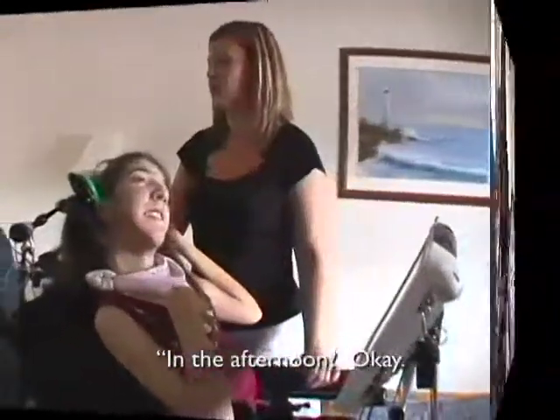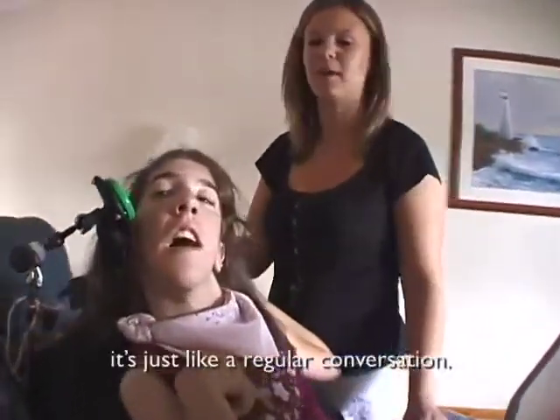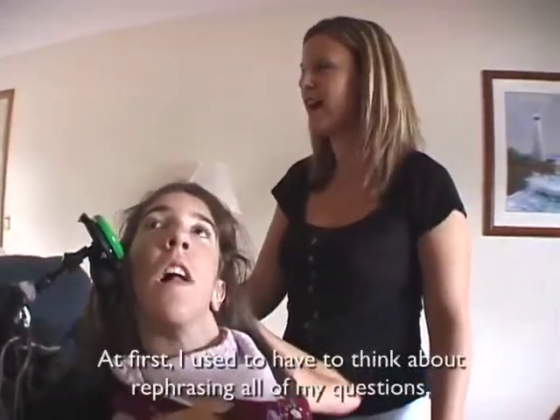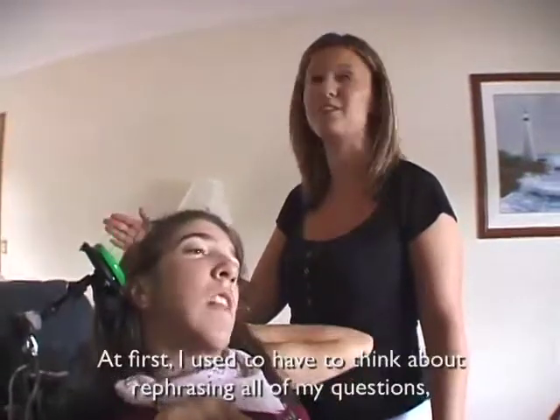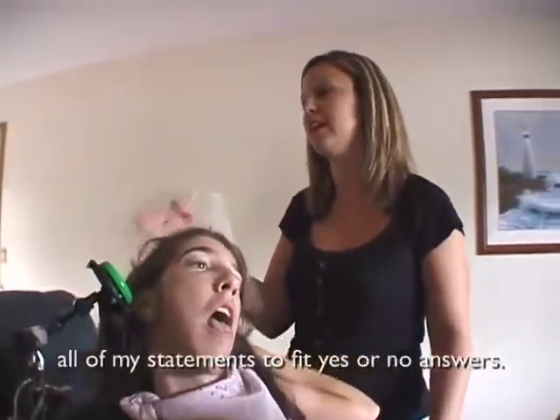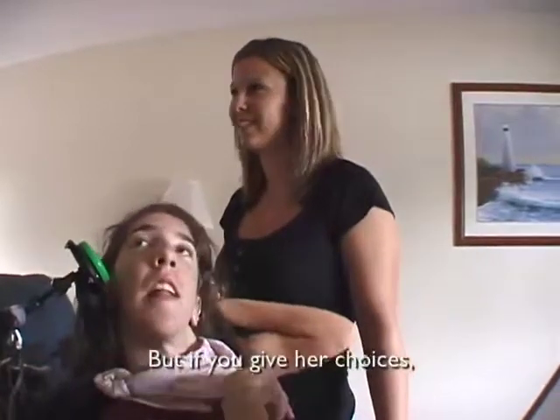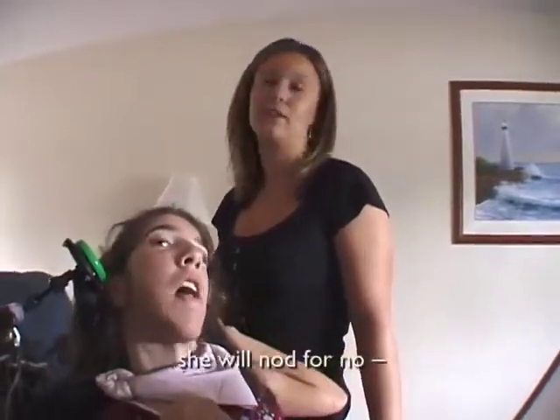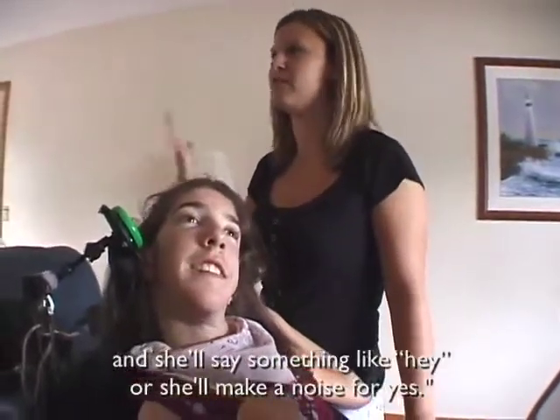When I talk to her during the day or whenever I'm with her, it's just like a regular conversation. At first, I used to have to think about rephrasing all of my questions, all of my statements to fit yes or no answers. But if you give her choices, she will nod for no and she'll say something like, hey, or she'll make a noise for yes.